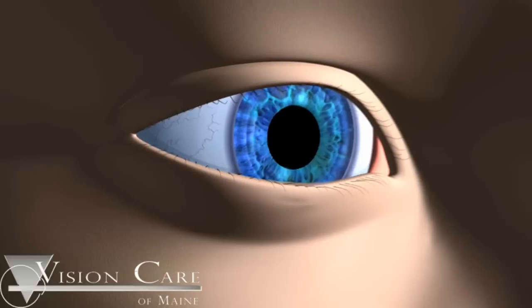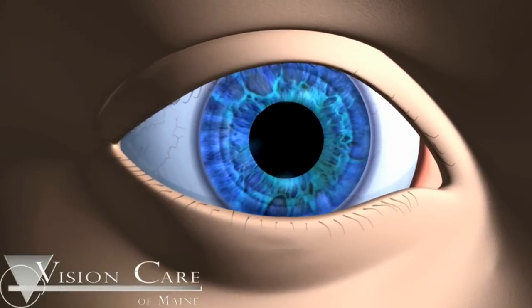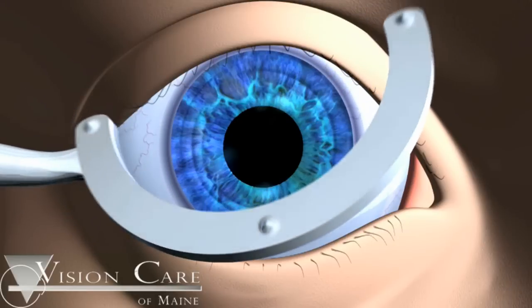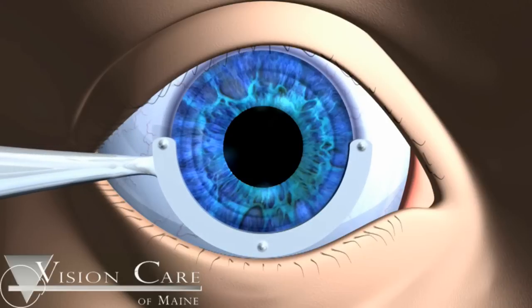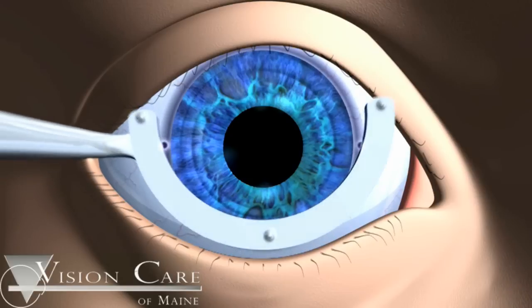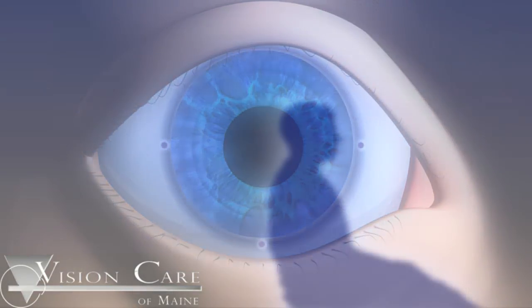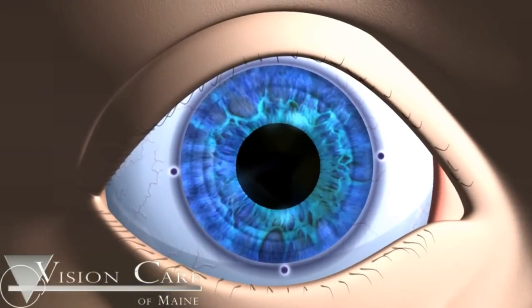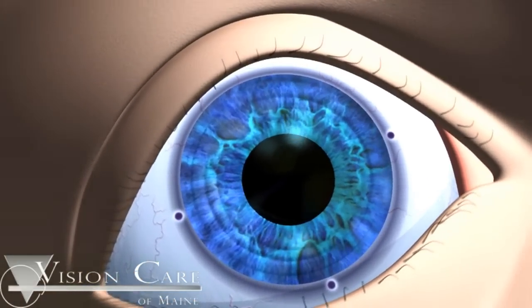To help the surgeon orient the ACRISOF IQ Toric IOL properly in the steep axis, a reference marker is used to mark the 0, 90, and 180 degree meridians of the cornea. The reference marks should be made prior to surgery, while the patient is sitting in an upright position. This avoids any errors in marking due to cyclorotation, a natural rotation of the eye that occurs when the patient reclines. Cyclorotation can cause the eye to rotate up to 10 degrees, creating the potential for imprecise marking of the steep axis of the cornea.